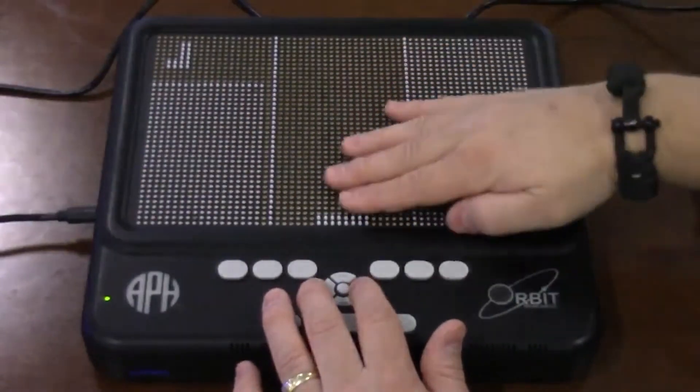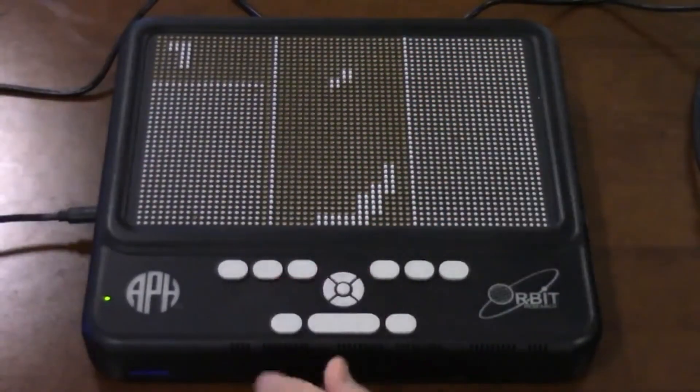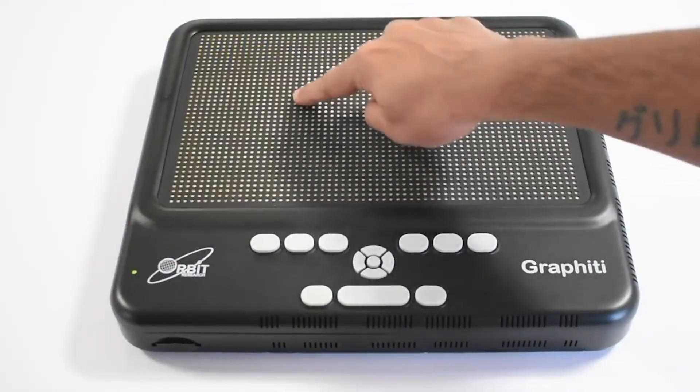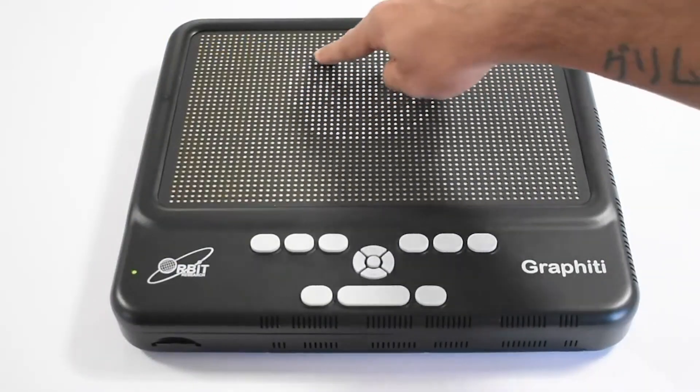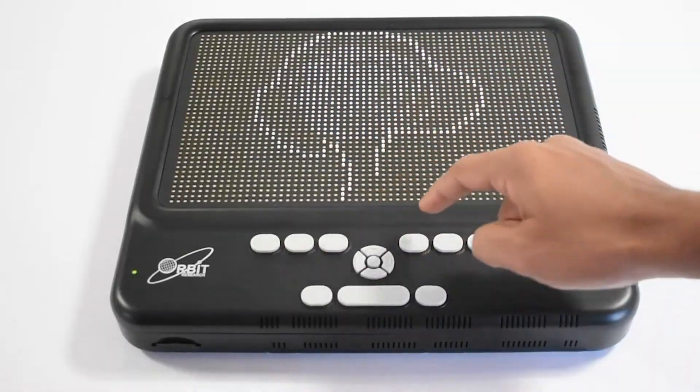There are many other features that make it a very powerful graphic display. One of them is the ability to actually draw. The entire surface is a touch screen and you can draw on it — I can show this to you.